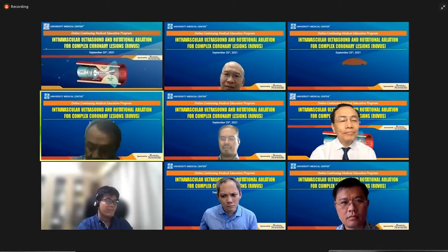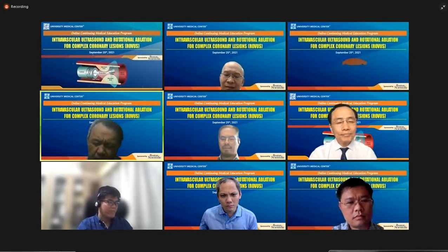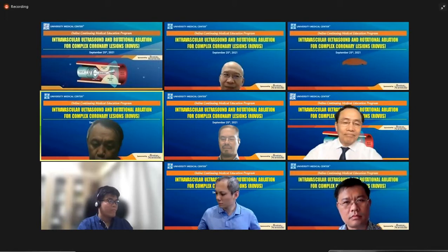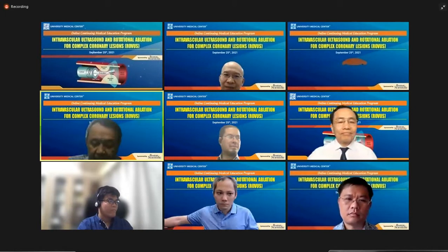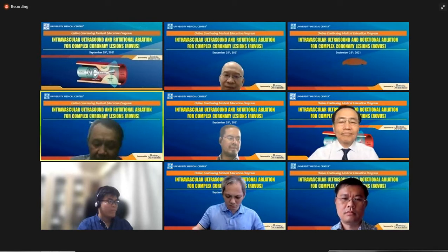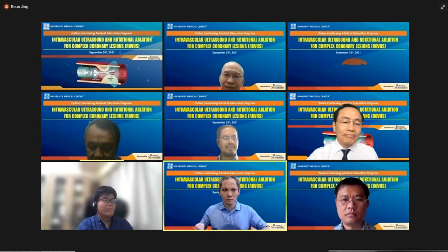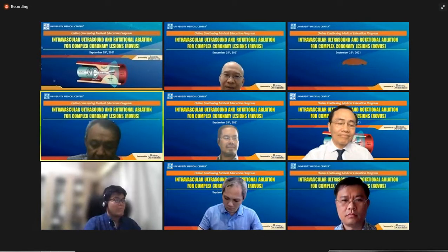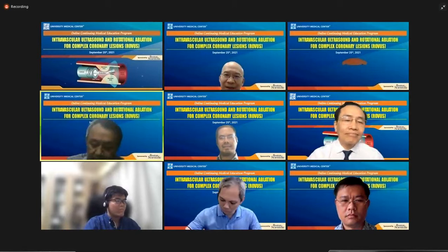The first question, because the ejection fraction in this patient is very low. In this case, I think if you have the IABP, it is very useful for the patient. It is safe for the doctor, the interventionalist, when we do the procedure. I agree with you. We can do the PCI.